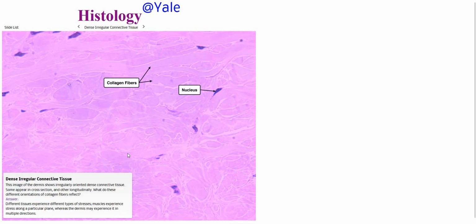And this is where the name comes from. So it's a dense tissue. There's not a lot of gaps per se in the fibers, and it has a regular pattern to it. Whereas if we compare that to irregular connective tissue, we've got fibers running in all different directions. And so this pattern is going to determine where we find these types of connective tissue.